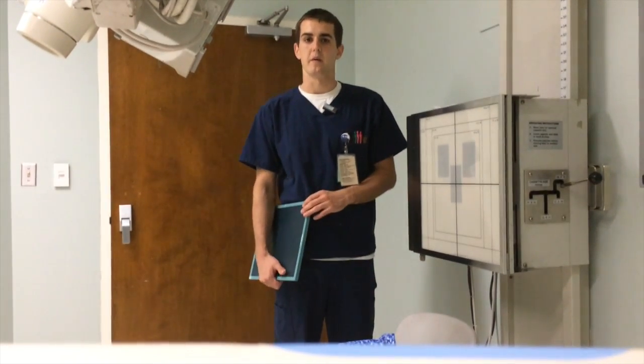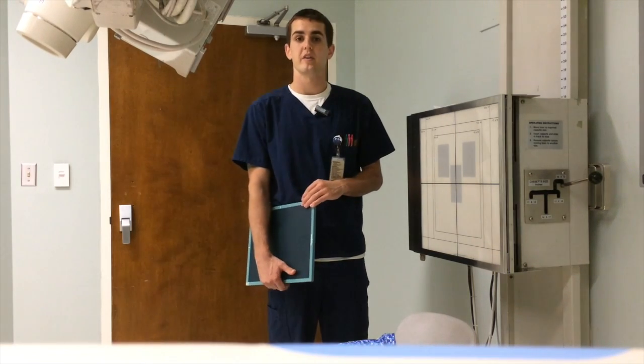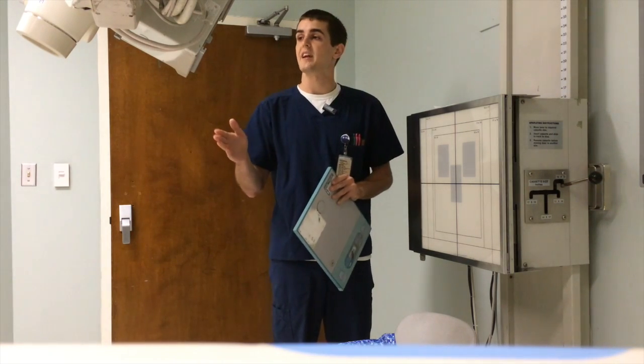Dustin Nelson, and today we're going to be doing 3 images for a Zygomatic Arch series. We have 10 by 12 because our hospital does not carry 8 by 10s. We have a 40-inch SID.